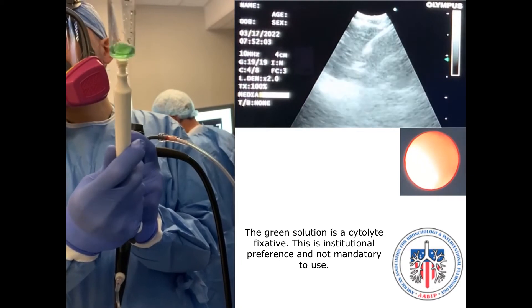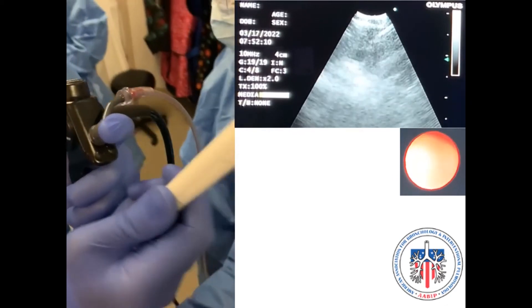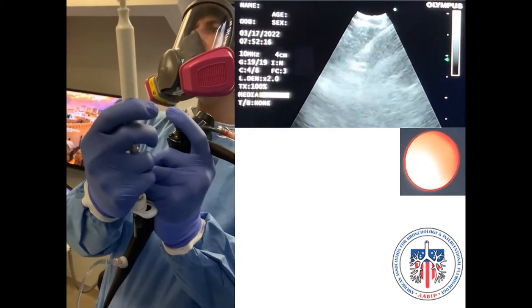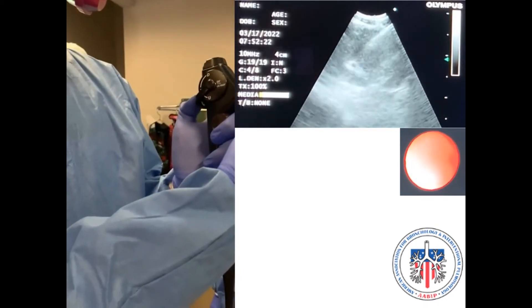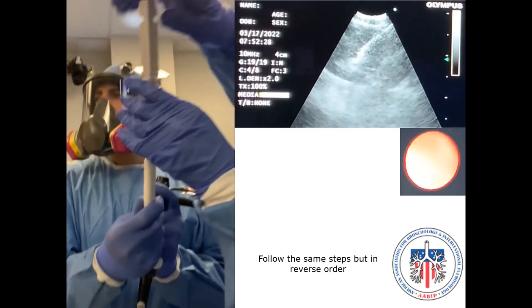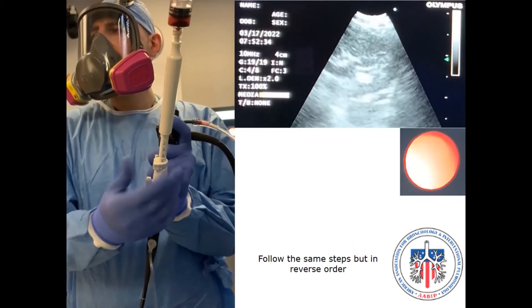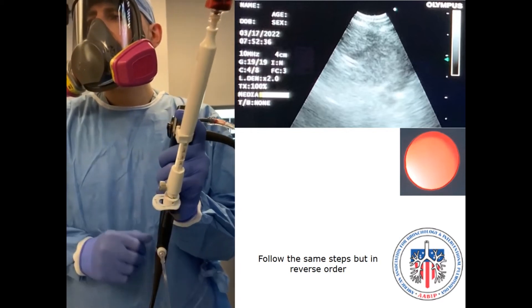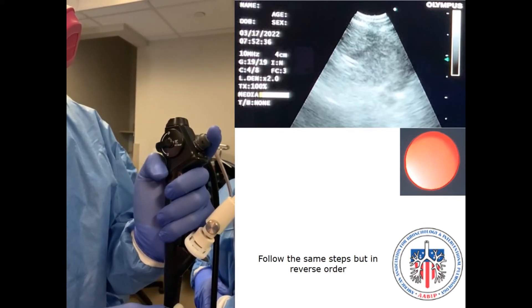It is advised to move the needle from capsule to capsule when possible, watch for blood return in the syringe, and re-adjust your sampling technique with subsequent passes if necessary. When sampling has been completed, follow the same steps but in reverse order. The jab technique allows for a quick penetration of the lymph node and requires a good estimation of depth to avoid overshooting and crossing the lymph node boundary into the surrounding structures.